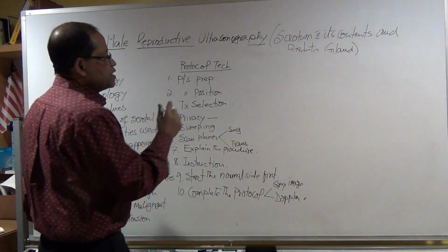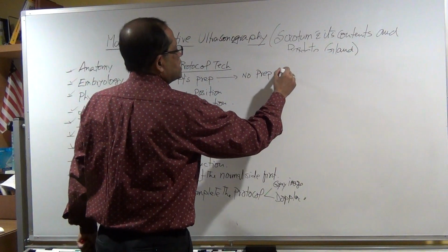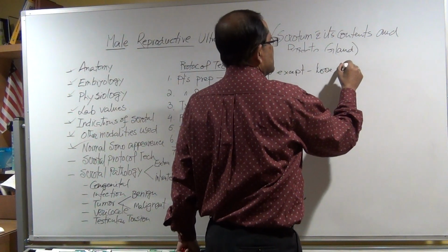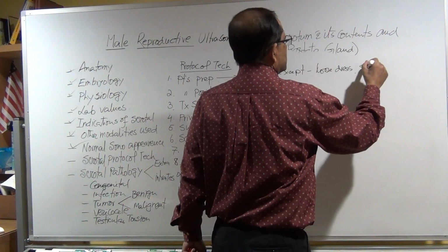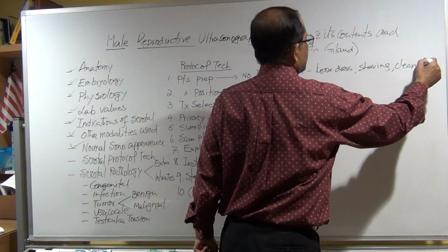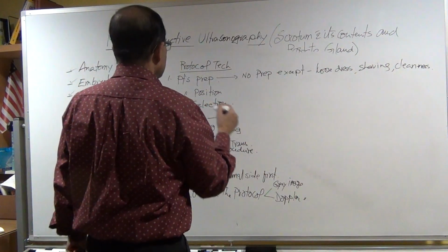So patient's preparation: no prep except loose dress and shaving, cleanness. Okay.